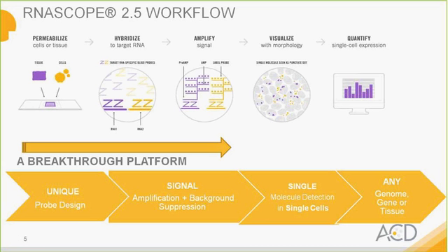Other webinars with more detail on how this works, and the video, are located on our homepage. It's important to note that for our RNAscope 2.5 assay, nothing is changing from the amp structure and probe design, and all of the same concepts apply.